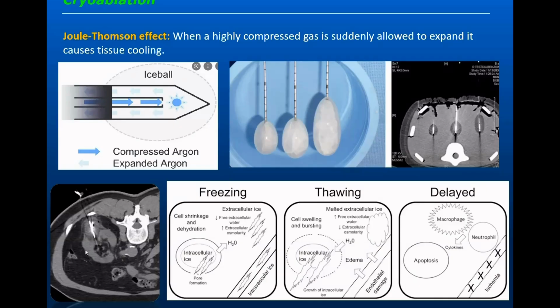Again, this is the kidney. This is the tumor. And you can see easily that the ice is forming around. So now you can easily tell that you have covered your tumor. I'm not sure if you can see it on your screen, but this is basically the original tumor, and you will see an extra darkness here. This is basically what we call the margin.